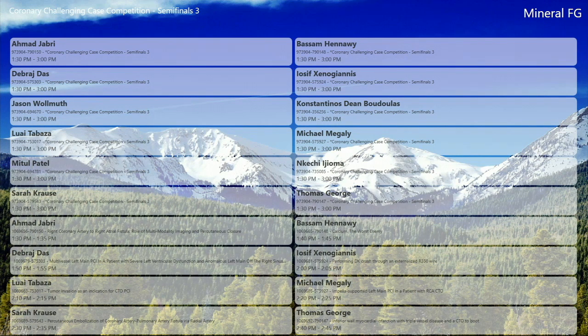So in general, there's kind of three types of coils. There's bare metal coils. Those are excellent for small vessels that you need to occlude, particularly distal wire perforations, because they go through an 014 microcatheter.